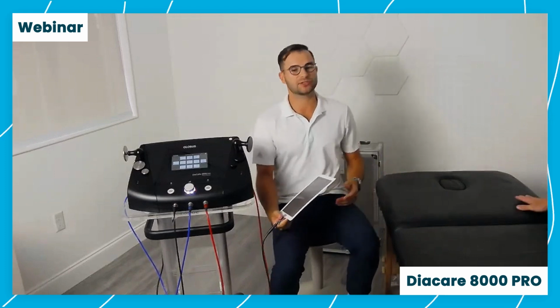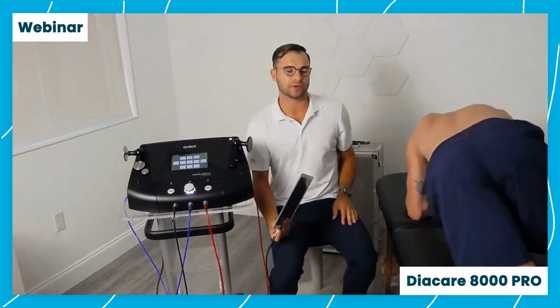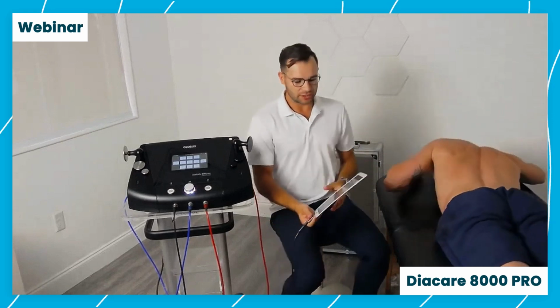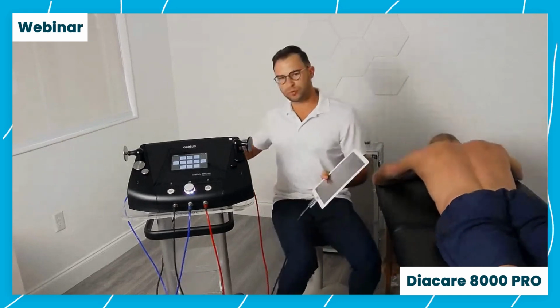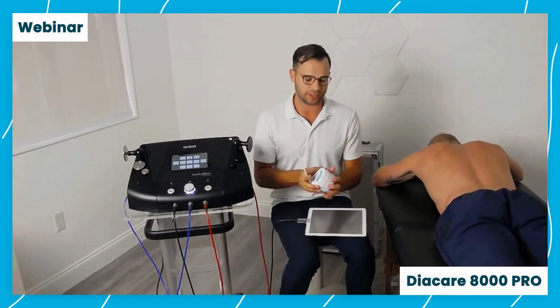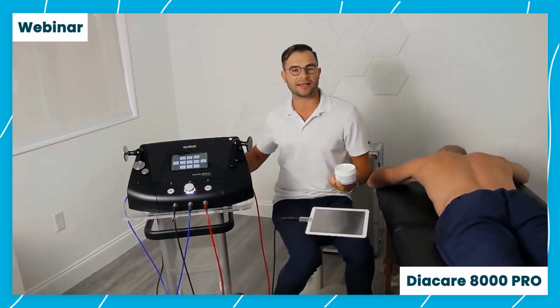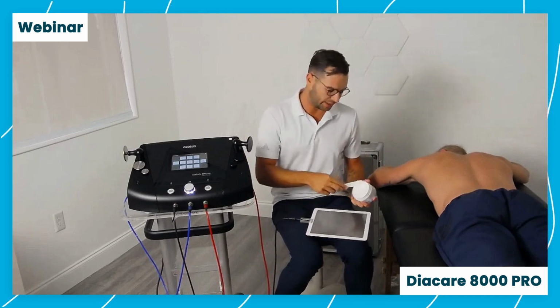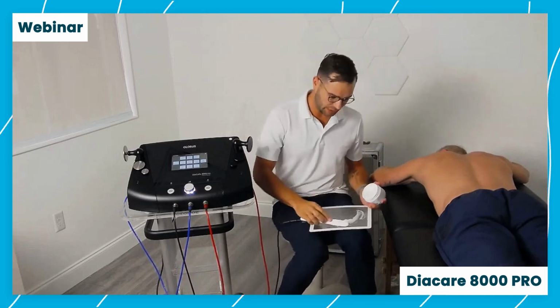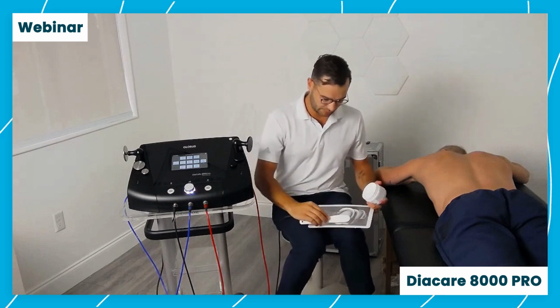So I'm going to have my patient lay down on the table here, and we're going to be treating the low back here, specifically the left lower portion of his lumbar spine. So important things that we have to do. We also have to use our cream here. We created a cream that has a conductive component and helps pass that energy from the active electrode to the return plate. So what we're going to do is we're going to spread some of this onto here, all right?